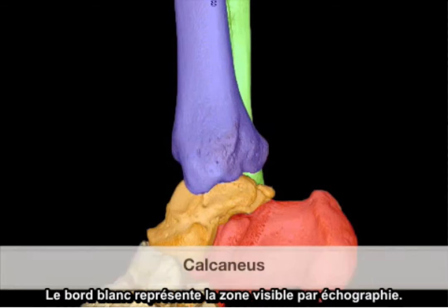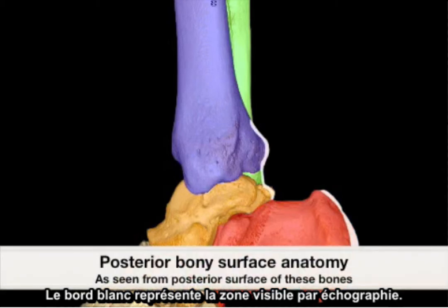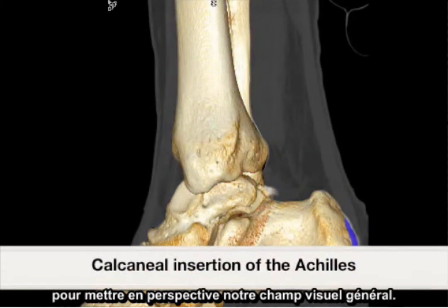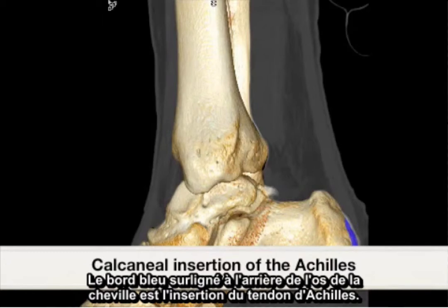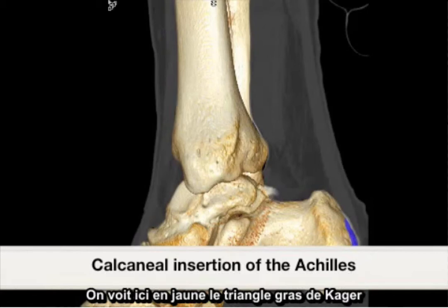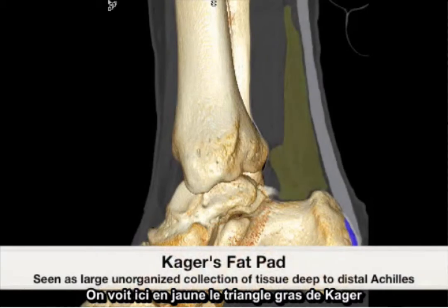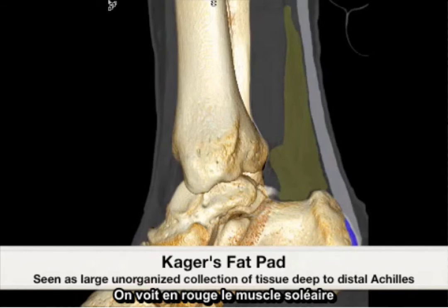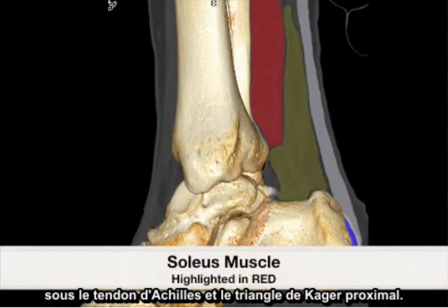This white rim represents the viewable surface anatomy by ultrasound. Here is a superimposed CT scan at the mid-sagittal line of the posterior ankle to put into perspective our general field of view. The blue rim highlighted at the posterior calcaneus is the actual insertion of the Achilles tendon. Highlighted in yellow represents Kager's fat pad as an unorganized collection of tissue deep to the Achilles tendon. The red indicates the soleus muscle, which is deep to the Achilles tendon and deep to the proximal Kager's fat pad.